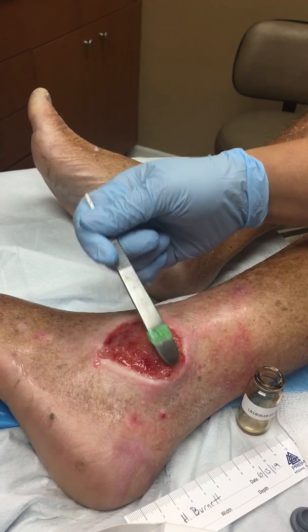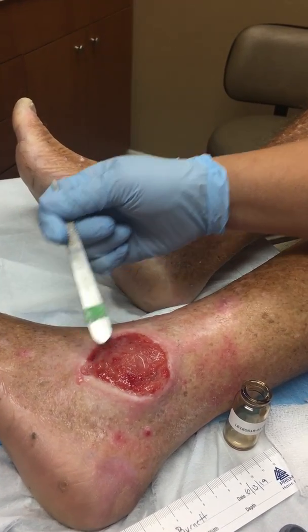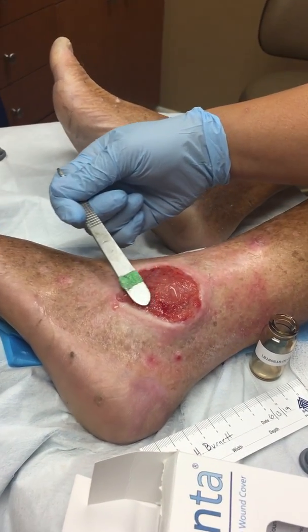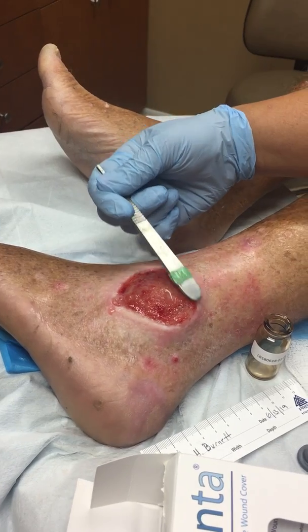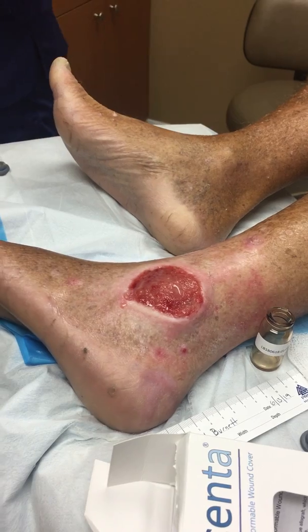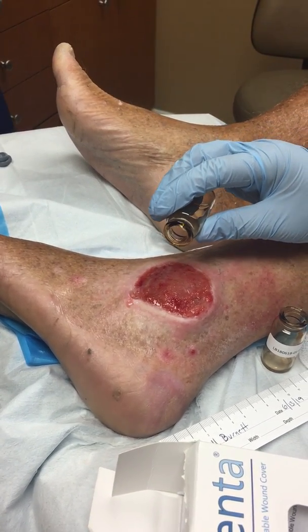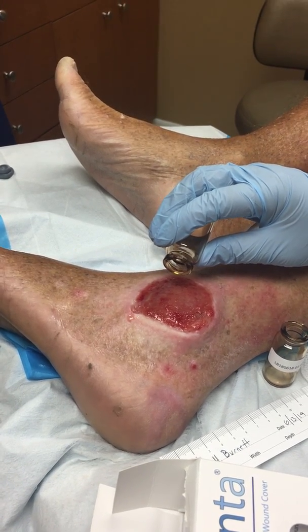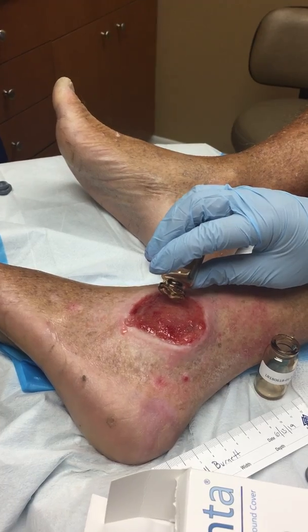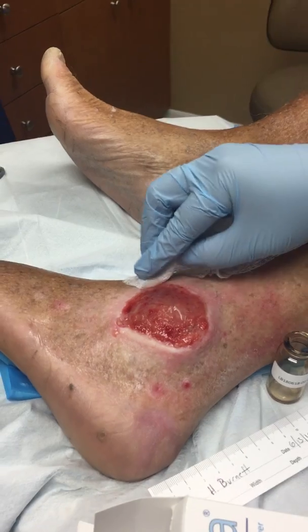I'm going to spread this out and make sure that we're hitting the wound edges. I was trying to cover most of that wound with those two pieces. I'm going to go ahead and add just a tad bit of the amniotic fluid over this, just to help it out, making sure we're getting all that along the edges.